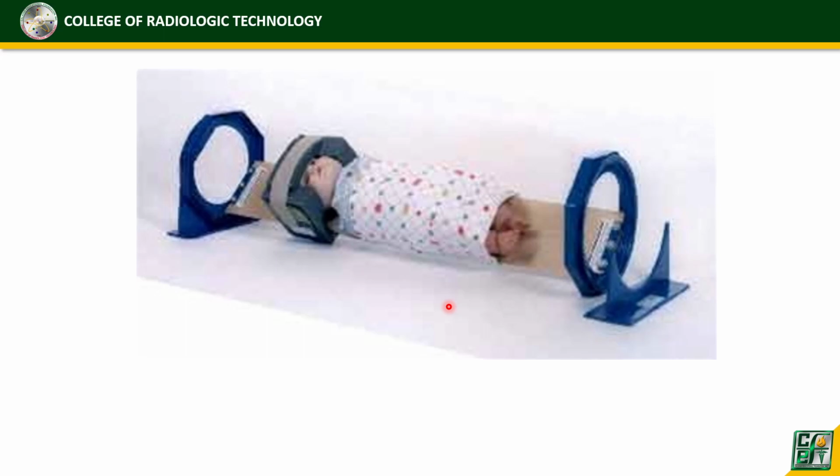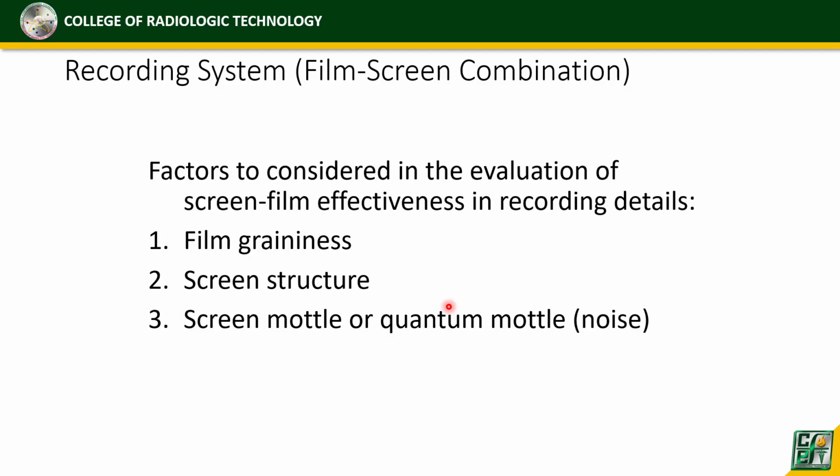Okay? So again, katulad ng pigostat, wala pa rin pa ako nakikitang ganyan na immobilization or restraint devices. Okay. Then the next factor is of course the recording system. Okay. Film screen combination or either sa pag digital either CR or DR. Okay?